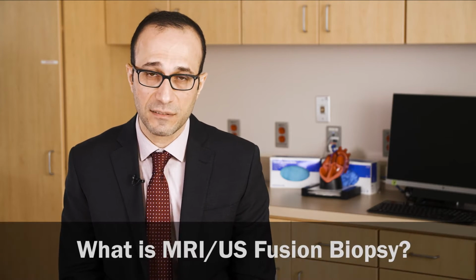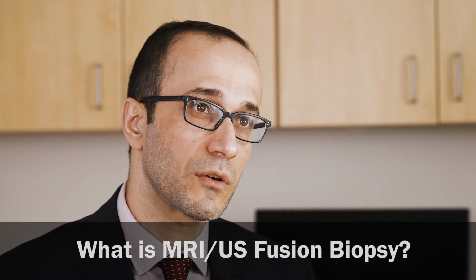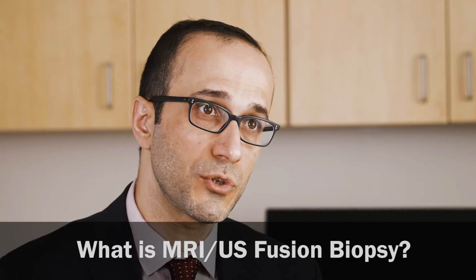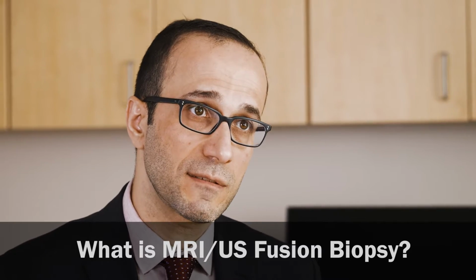And that's when you will be referred to your urologist again, who would consider doing an MRI ultrasound fusion biopsy. What do we mean by that? On your end, this is just like any other biopsy where there will be an ultrasound probe introduced through the rectum, and then scanning images will be obtained. The urologist and his team, typically nurses who assist him during the procedure, would try to fuse these images to the best accuracy that they can get.